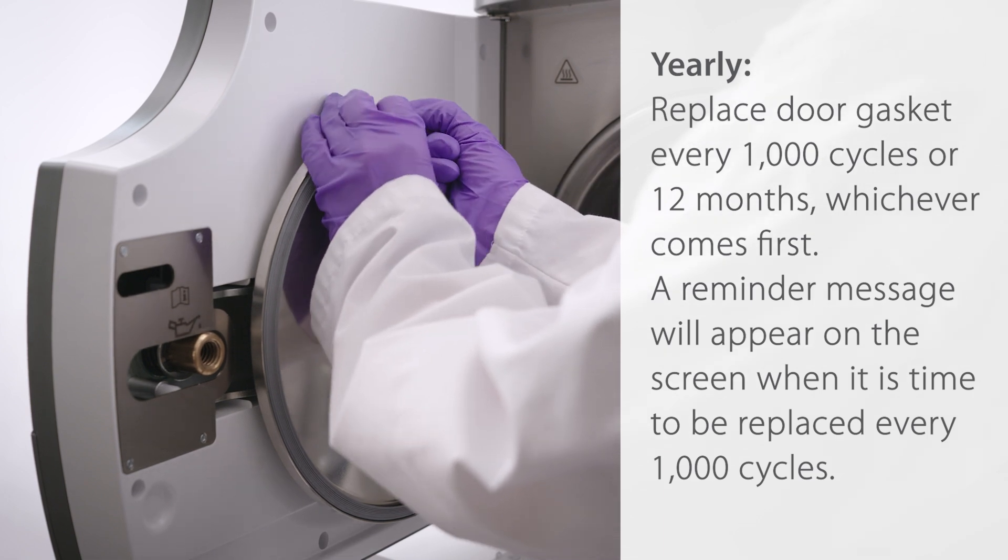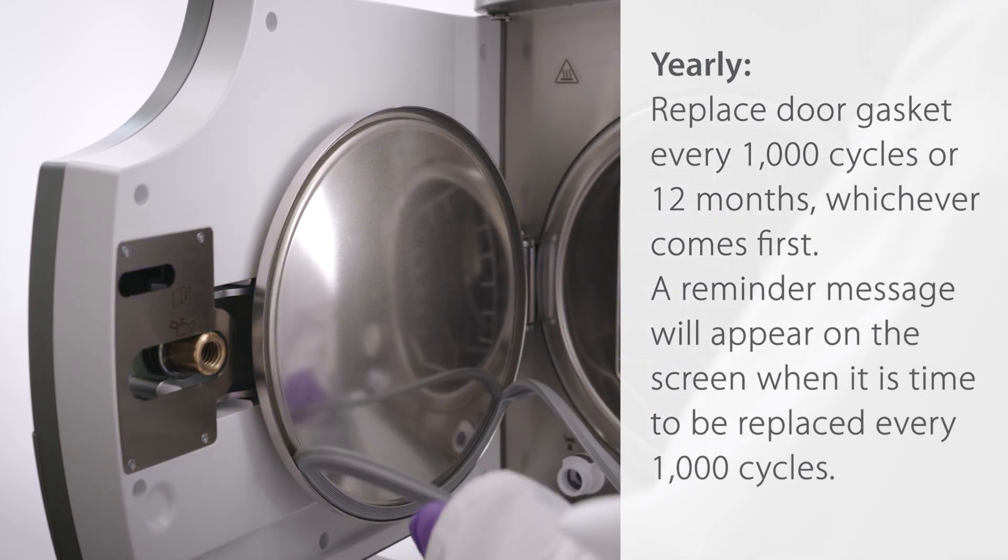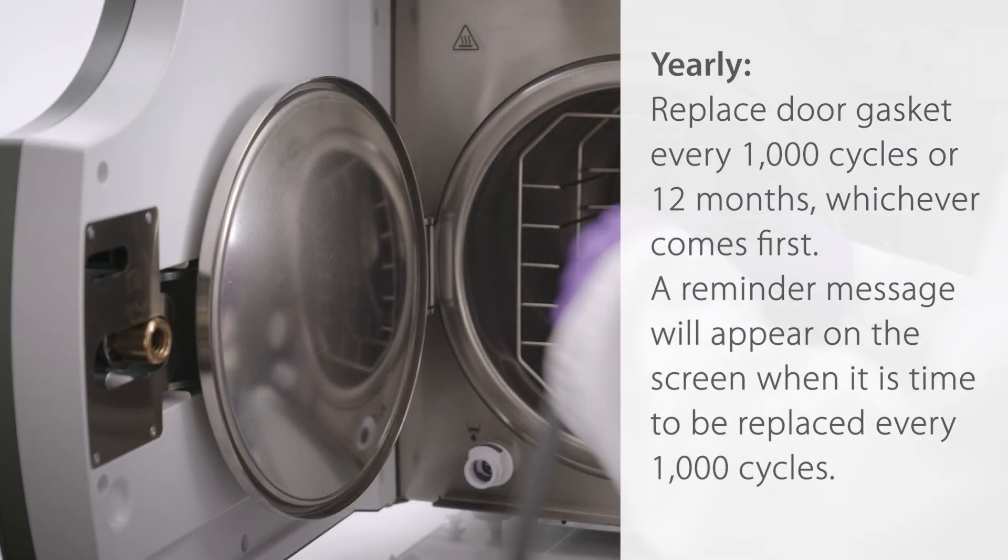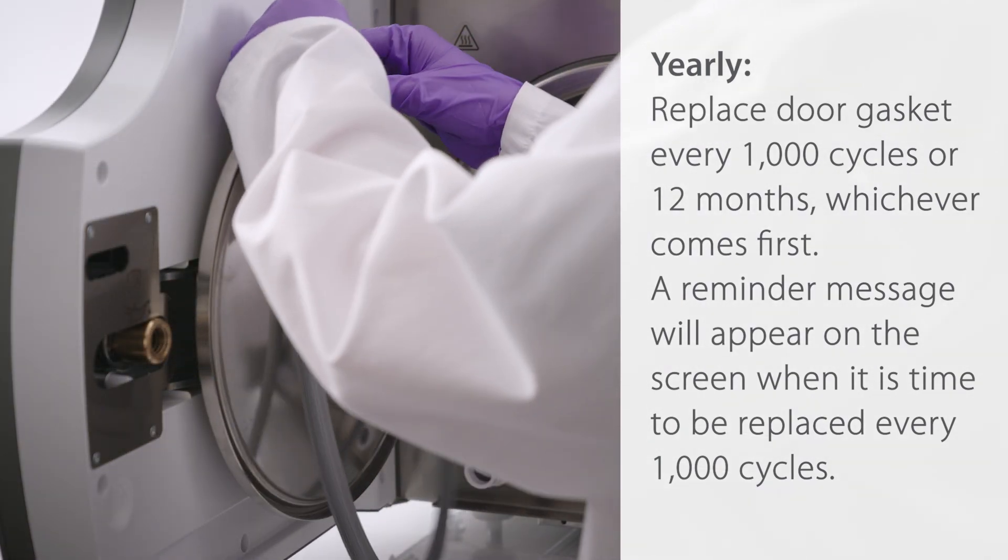Yearly, replace the door gasket every 1000 cycles or 12 months, whichever comes first. A reminder message will appear on the screen when it is time to be replaced every 1000 cycles.